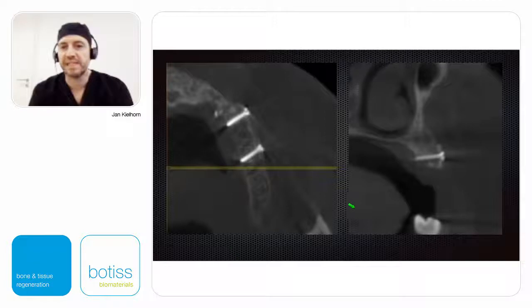Also, in this case, you will see that there's nearly no cortical visible anymore. And very interesting also is that you see that is the plate, and following the plate you see a very dense line. So the bone really takes the information and it transforms to really a copy of the natural principle, which we found very amazing when we first saw that in a cone beam CT.